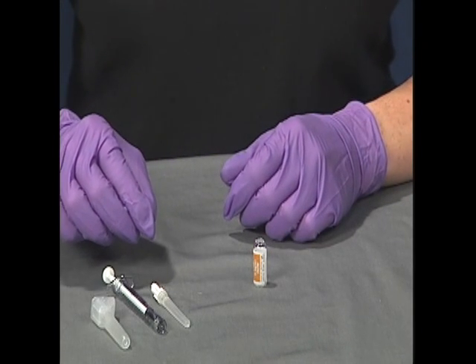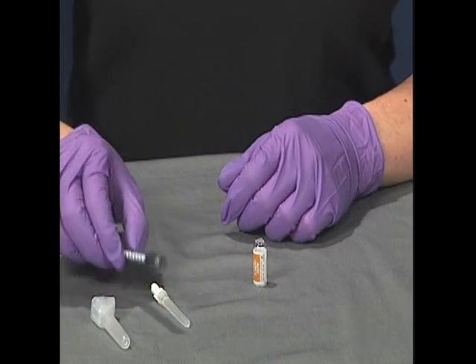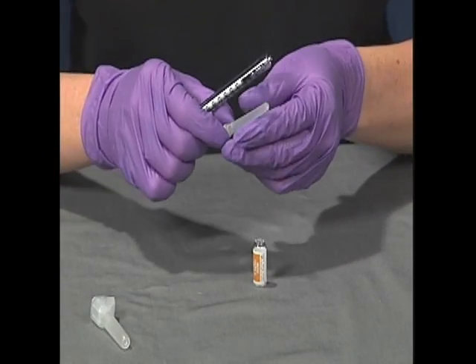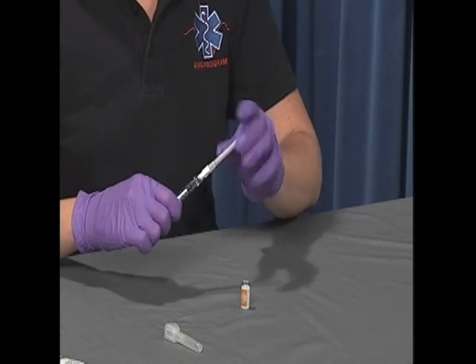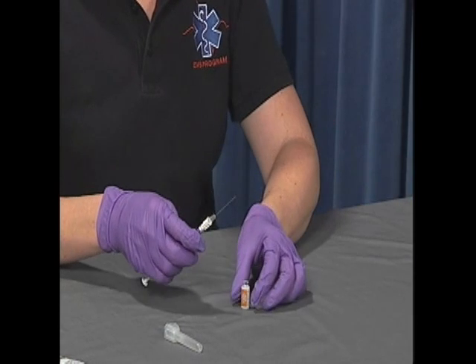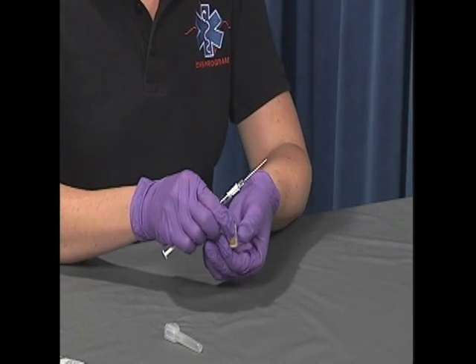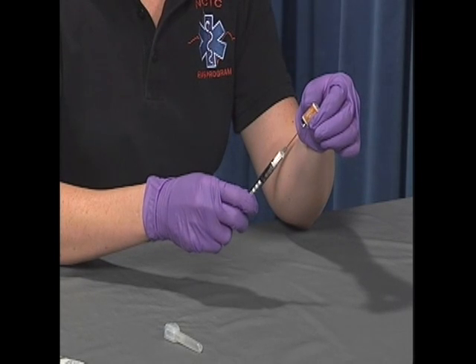If the ampule fails to break cleanly and glass shards can be observed, dispose of the ampule and replace with another unit. Now prepare your filter needle and syringe in order to withdraw medication for administration. Invert the ampule while inserting the filter needle and withdraw the medication.